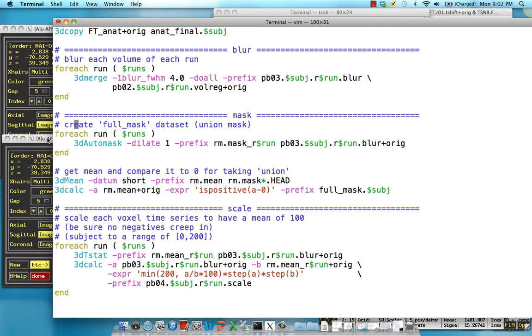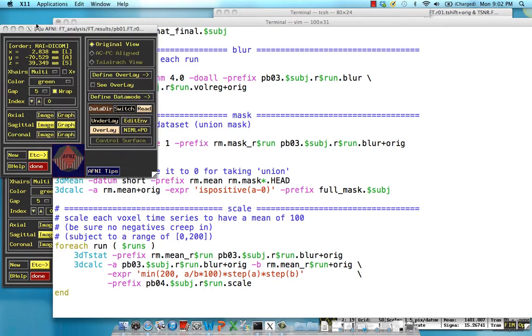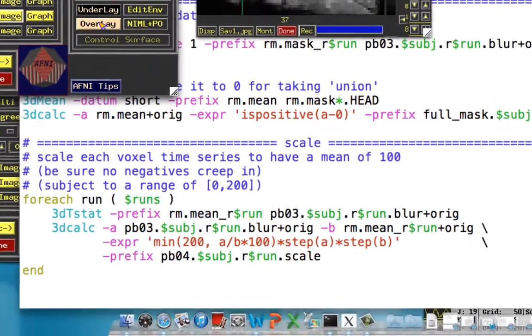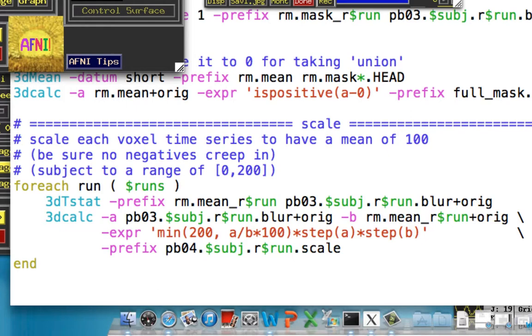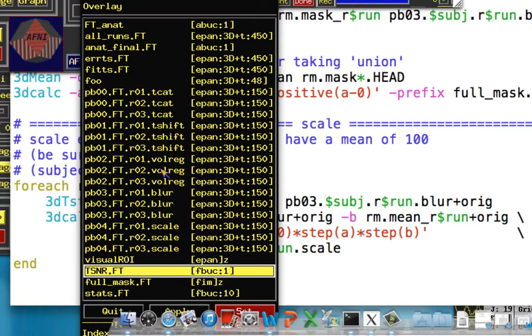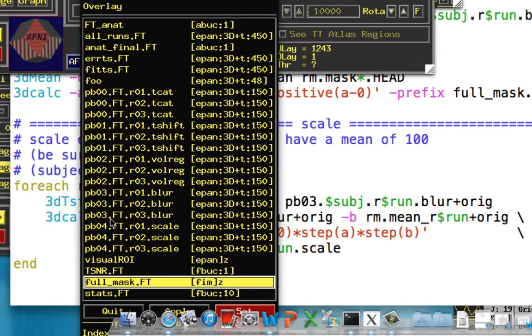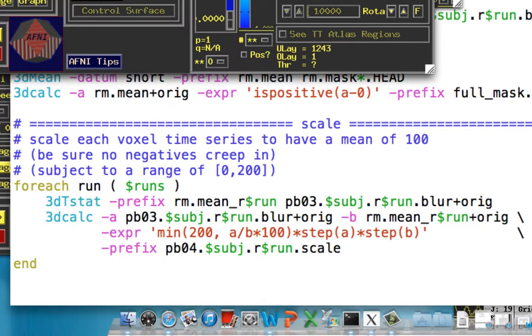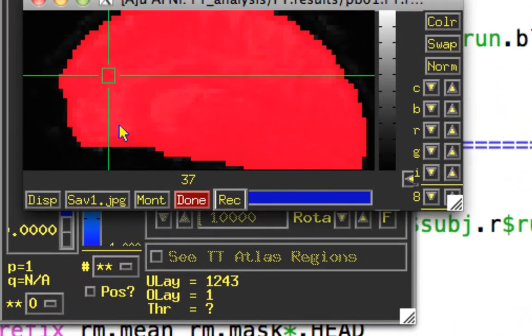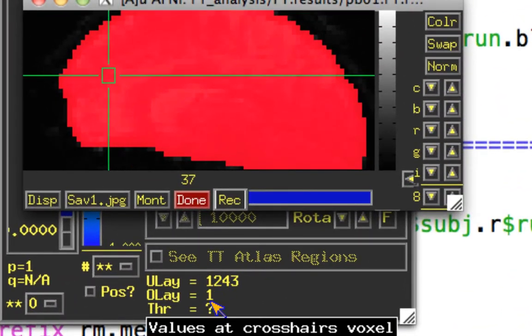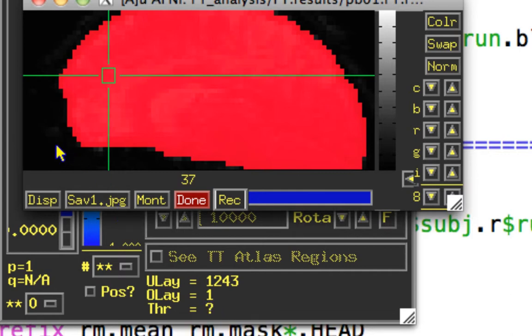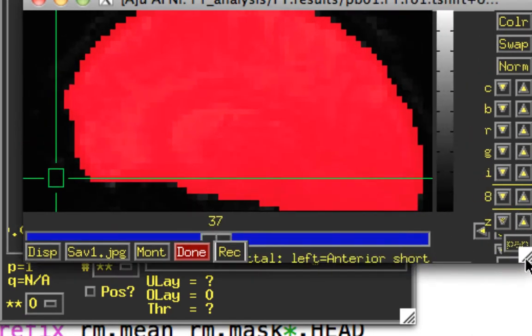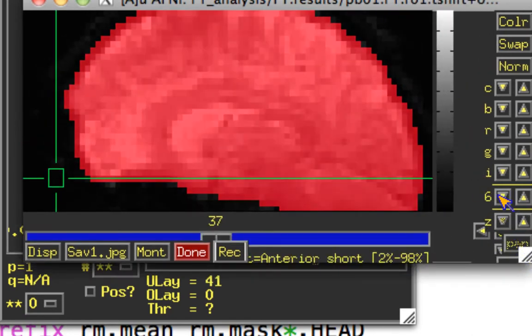All right. So the output of that is something called full mask. So that's across all three runs. And again, if we look at this, and as an overlay, we put this full mask on. Here is what it looks like. It's all red because it's all one color. You can see this overlay value as one. So one where it's the mask and zero where it's not. You can toggle this opacity button right here to see it a little bit better.